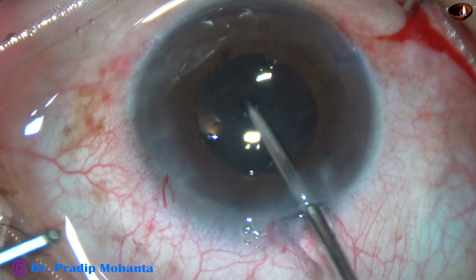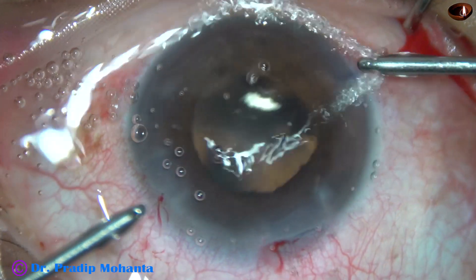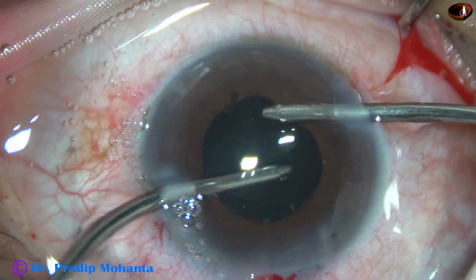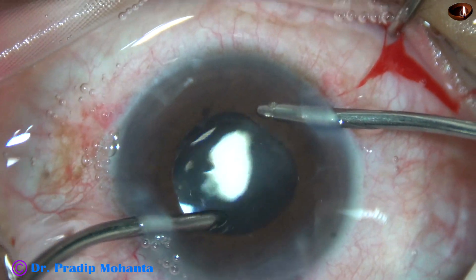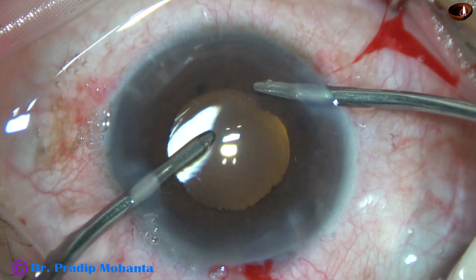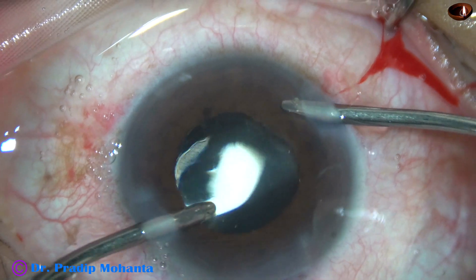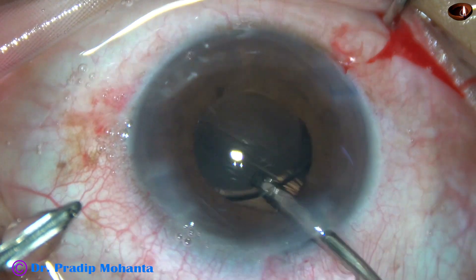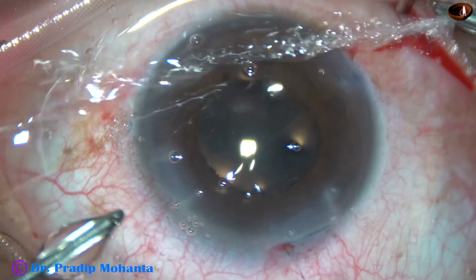Let us review what to do if the Bhex comes off. We have to support the Bhex with the chopper so that it doesn't come to the corneal endothelium. And in this case, I did that. And then I supported the Bhex with the phaco needle, injected some viscoelastic, reapplied the Bhex, and removed the Bhex before implanting the intraocular lens.